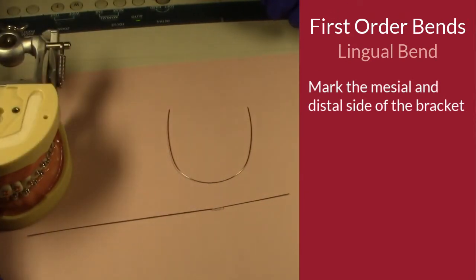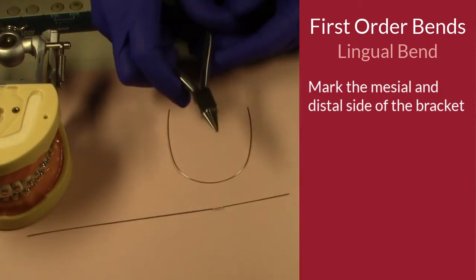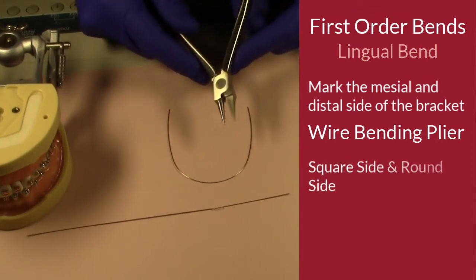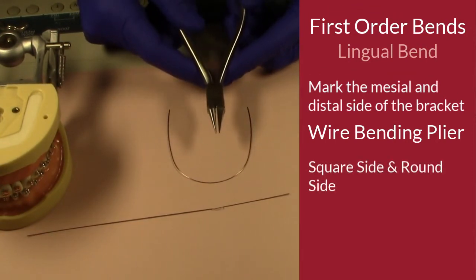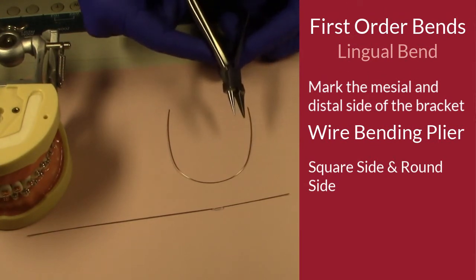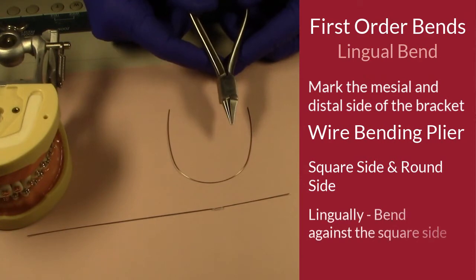I'm always going to use a wire bending plier. It has a square side on one side and a round side on the other, and they both serve their purpose. So if we're moving lingually, we always want to bend against the square part of that plier, okay?